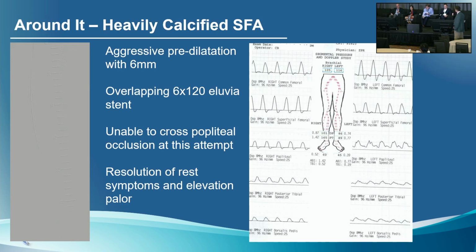What I was really getting at with my question is that I'm anticipating you had a lot of challenges recanalizing this, that it's probably heavily calcified, and I'm wondering what kind of stent result you have if you were to look with IVUS. Wondering if you had looked beforehand, if it might have changed. We did not put the IVUS in afterwards. I did not take out another IVUS catheter and put that down there after we stented.